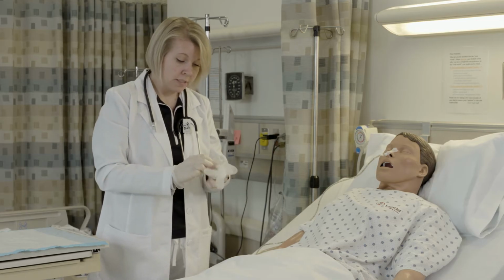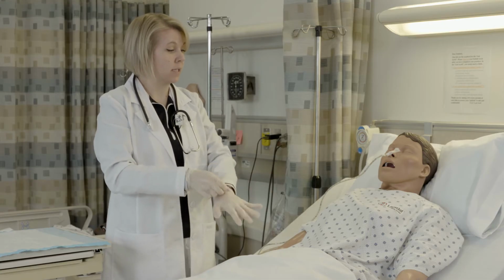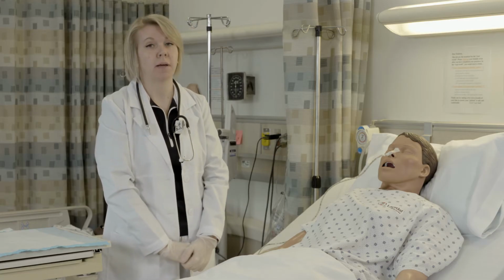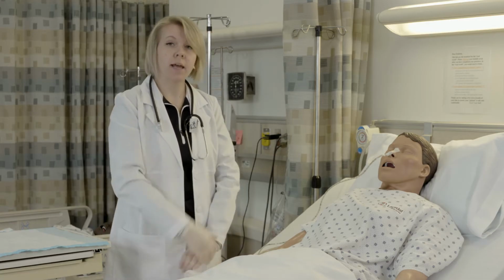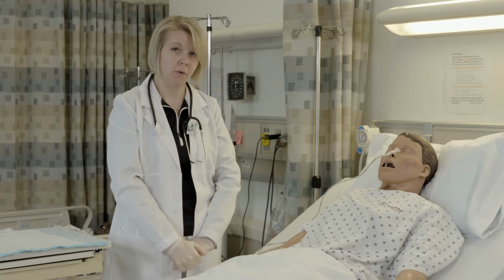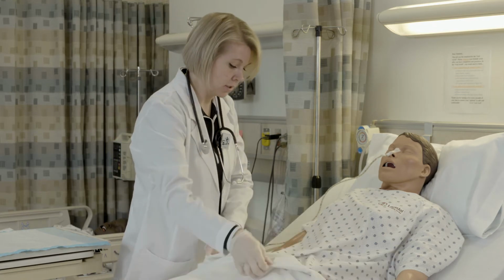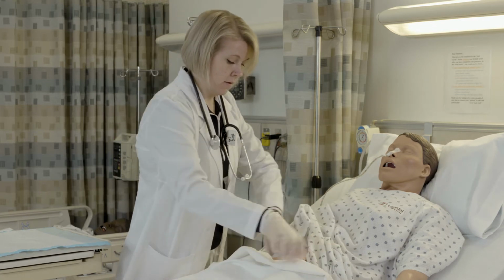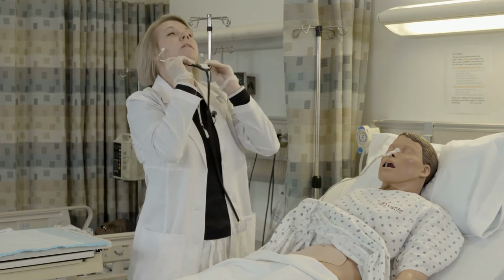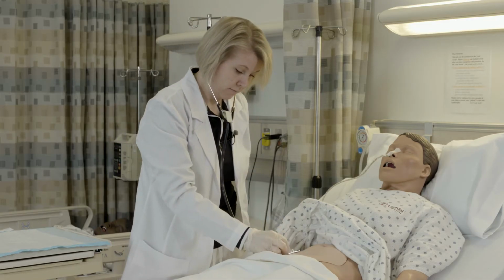The next thing I'm going to do is any pre-assessments prior to giving these medications, such as vital signs, or checking any labs before I give these medications. Then, since he already has the NG tube in, I'm going to do an abdominal assessment just like I did prior to putting the NG tube in. So we'll start and let the patient know I'm going to listen to his stomach. We'll start in the right lower quadrant, checking all 4 quadrants for bowel sounds.